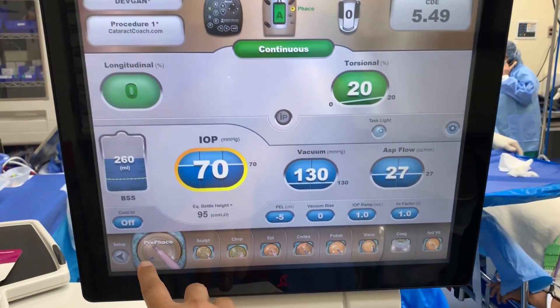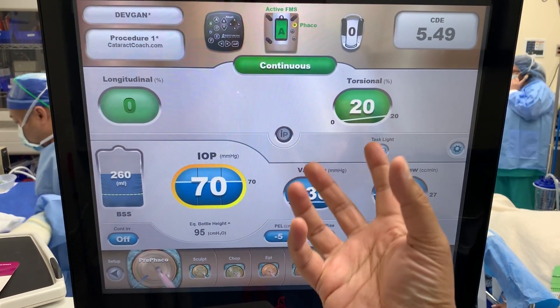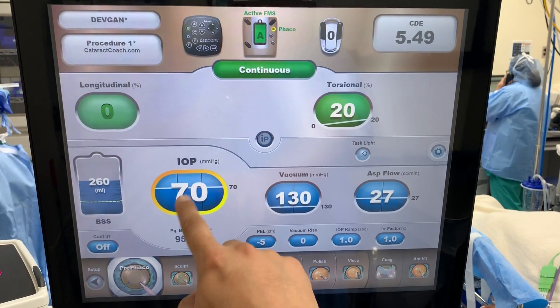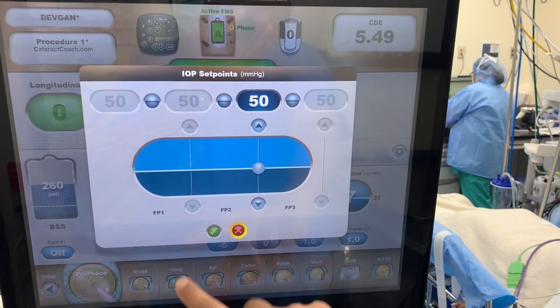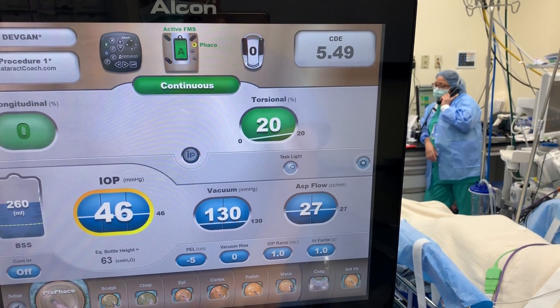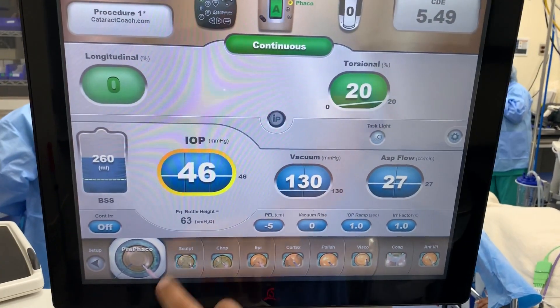Starting off with pre-FACO, the goal here is just to remove some of the anterior cortex to access the nucleus. So we can decrease the infusion pressure here — 70 is too much. Let's try about 50 or even less in terms of millimeters of mercury, which is a bottle height of about 60 centimeters. Now the vacuum is low, flow is relatively low — those are appropriate — and a low amount of energy.